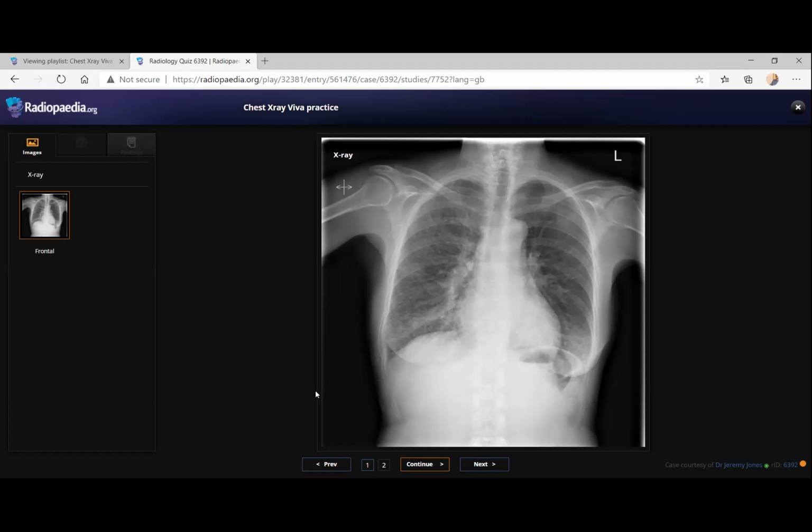Usually in this case the patient will be under care, already on treatment. So you don't have to refer them again to the MDT and do the CT chest and abdomen again. They are just coming for the follow-up. So you tell that you will compare the previous films. And if there is any recent change in symptoms, then you have to do a restaging CT. If you see anything new, like a new node or a new lesion, I'll do further imaging, and you just have to compare the previous films.